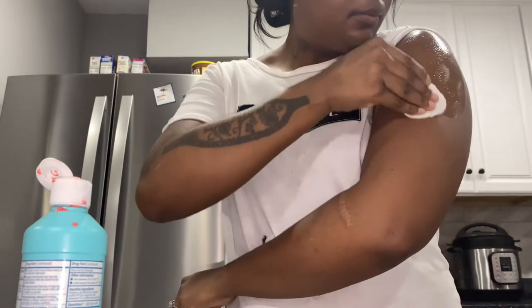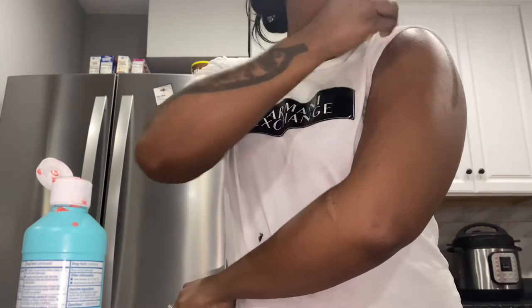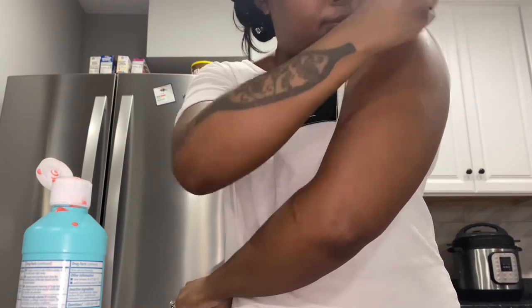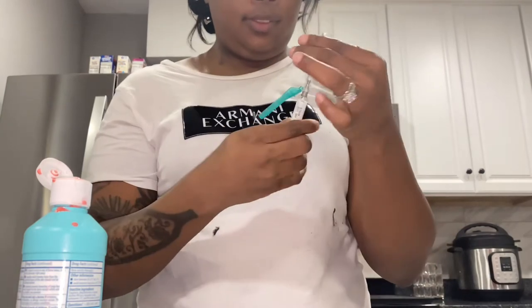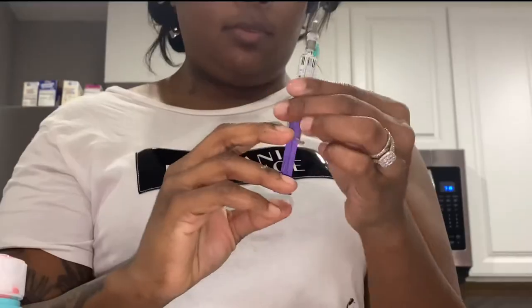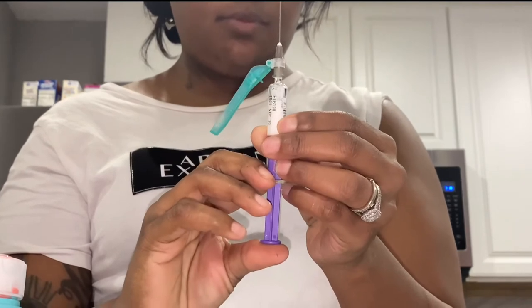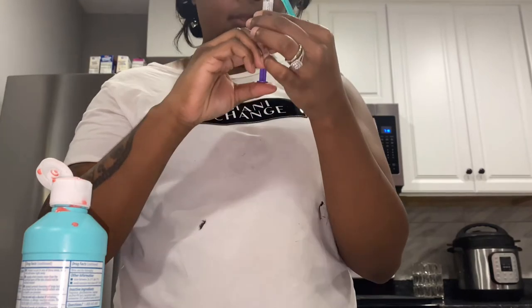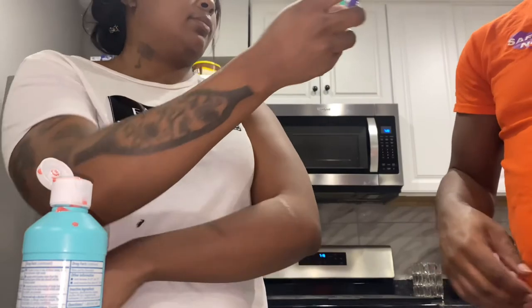I was going to have hubby put the needle in for me because I was nervous, but then I was nervous for him to do it because I didn't want him to be rough. I'm not afraid of needles, but this is my first time ever giving myself a needle, which is something different. Here I'm pushing the air out of the tube slowly to make sure none of the medicine came out.